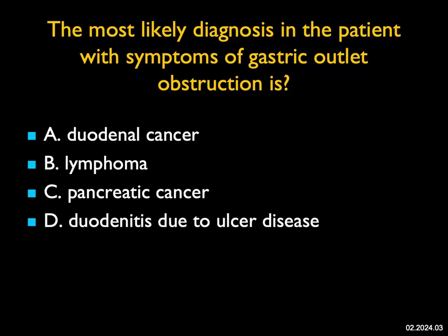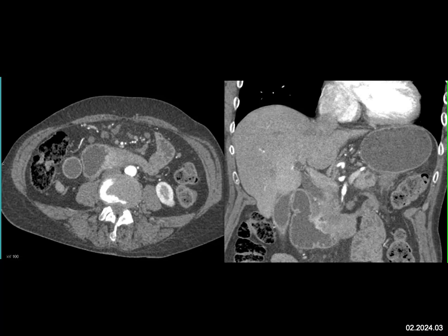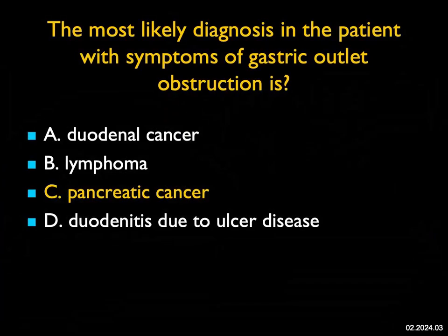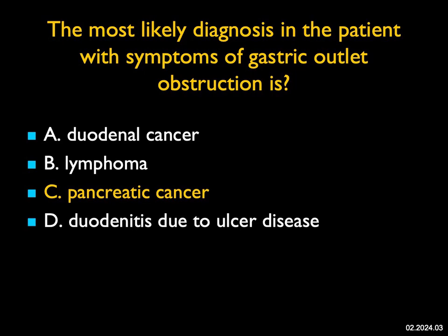The most likely diagnosis in this patient with symptoms of gastric outlet obstruction — gastric outlet obstruction makes you worry about something in the stomach, an antral tumor, ulcer disease. You also recognize that things in the duodenum or even proximal jejunum can present as gastric outlet obstruction. What we see here is obstruction of the duodenum by an infiltrating tumor. You could consider duodenal cancer or lymphoma, but when you look carefully, particularly on the coronal view, there's actually a mass in the head of the pancreas. The mass extends to and involves the duodenum. This is a good example of pancreatic cancer invading the duodenum.